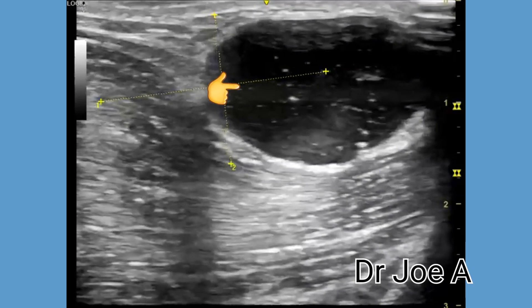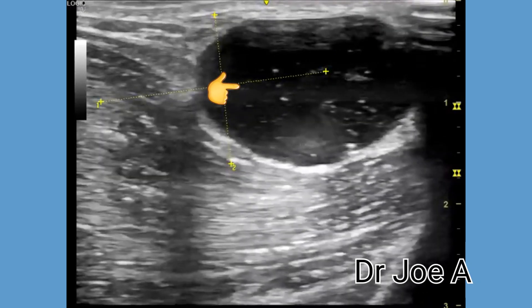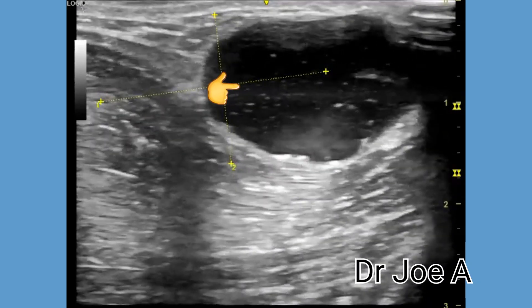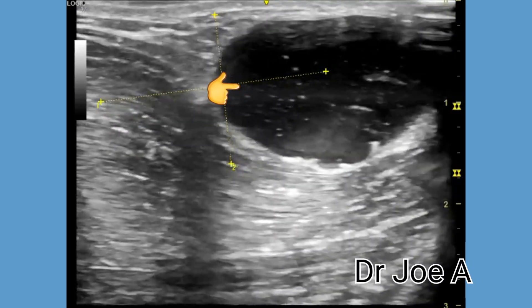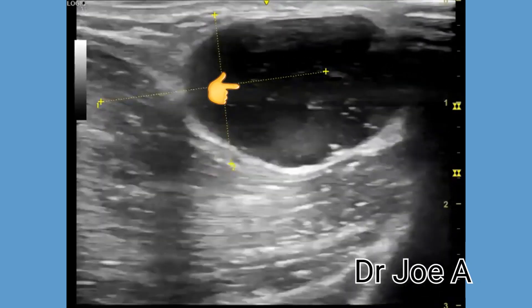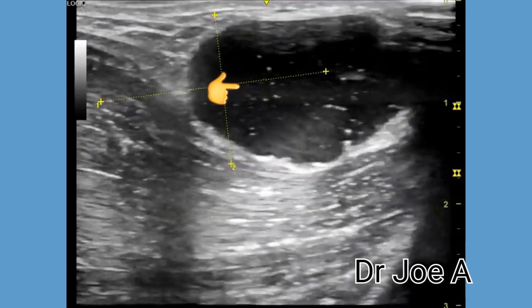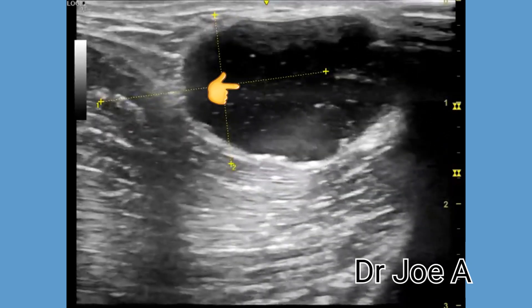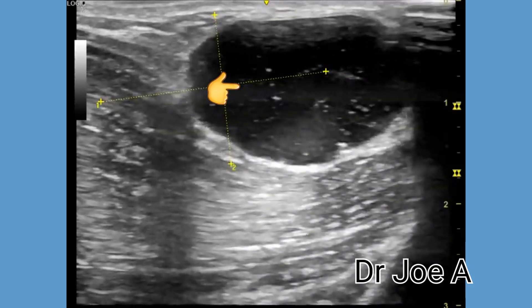A ganglion cyst is a cyst that can develop from the joint or tendon sheath and can vary in size from the size of a pea to that of a golf ball.